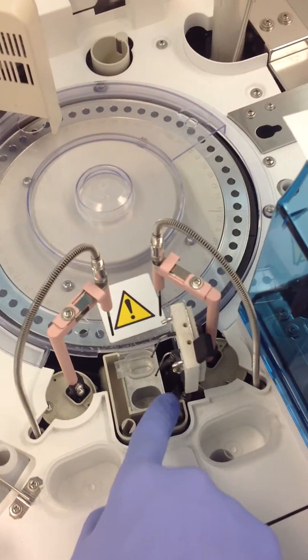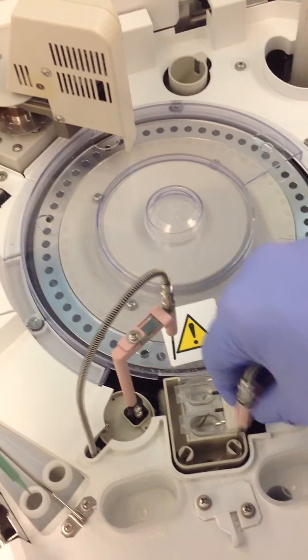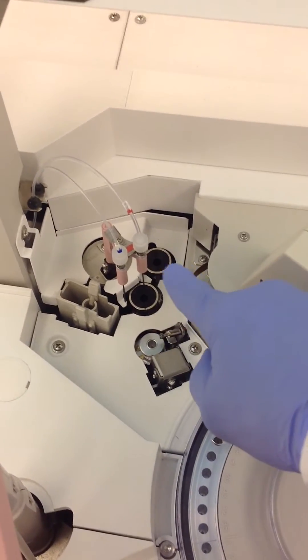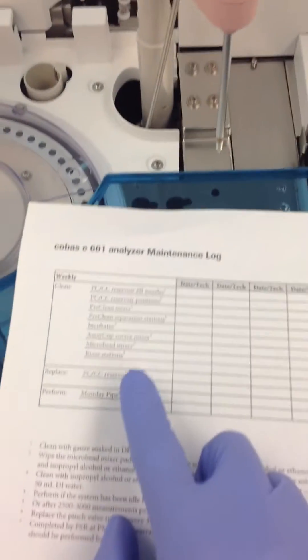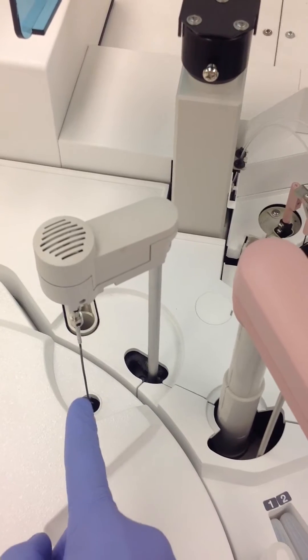You can also clean out the reservoir position — it tends to get a little grimy pretty quick. The mixer separation stations and incubator are all similar: you're pretty much going to look for debris in any of the holes, and you're going to clean it with a Q-tip or some other device that will fit down there. Then we have the Vortex microbead mixer — you want to be really gentle when you clean it and try not to bend it.